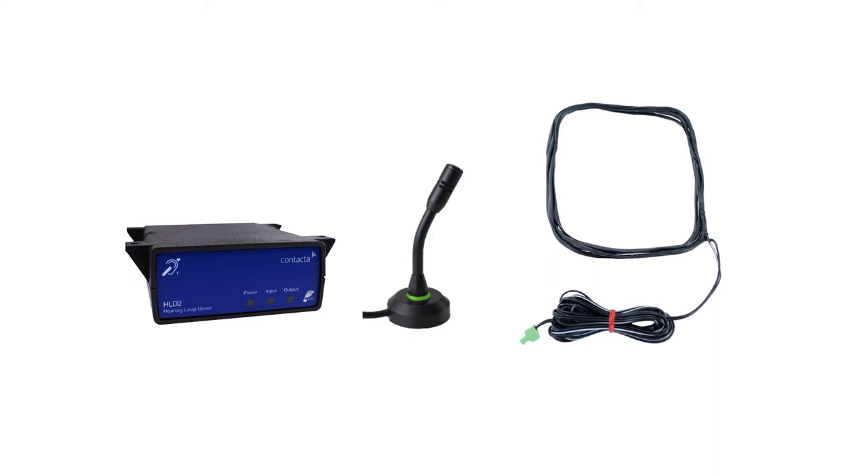An under counter loop system kit includes the following components: a hearing loop driver, a microphone, a counter hearing loop aerial, a power supply, fixings and signage.